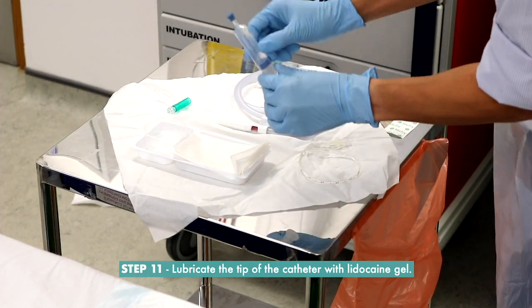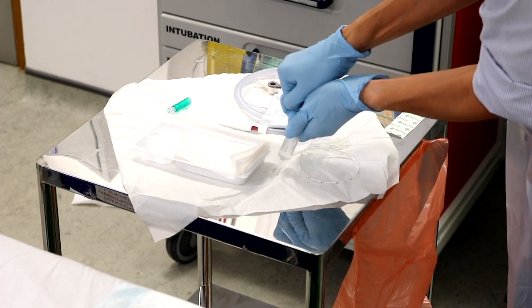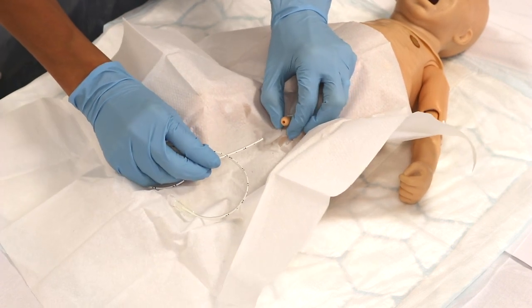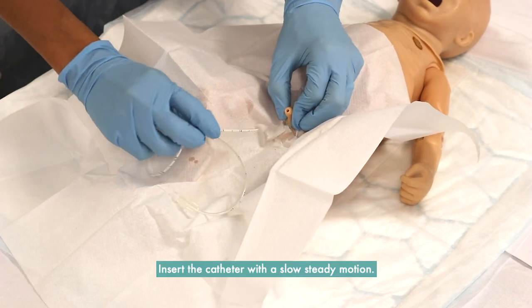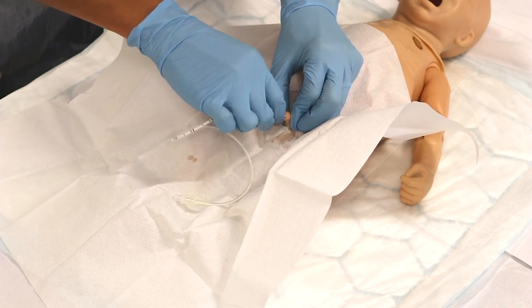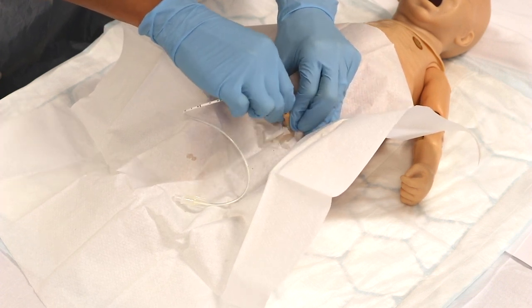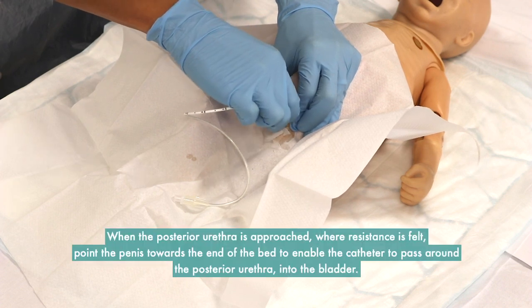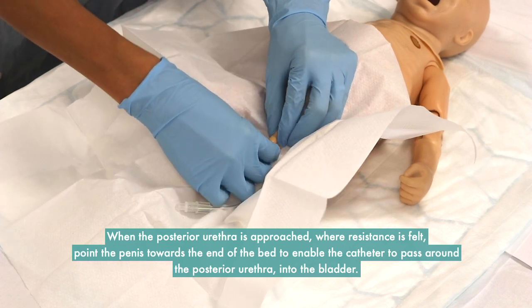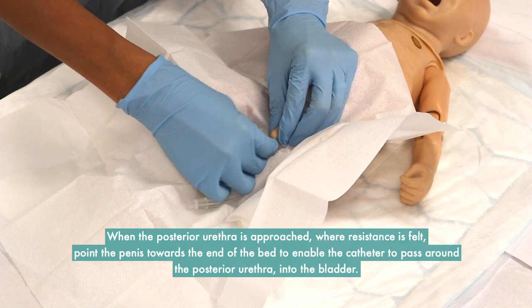Step 11: Lubricate the tip of the catheter with lidocaine gel. Gently insert the tip into the urethral meatus and insert the catheter with a slow, steady motion. When the posterior urethra is approached and resistance is felt, point the penis towards the end of the bed to enable the catheter to pass around the posterior urethra and into the bladder.